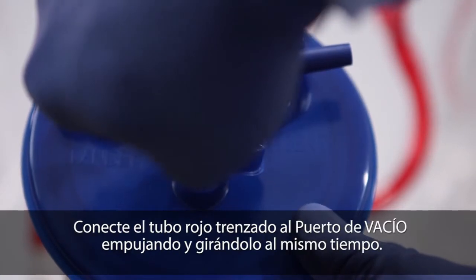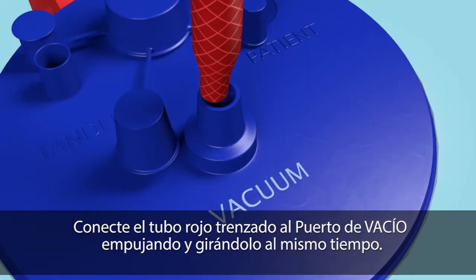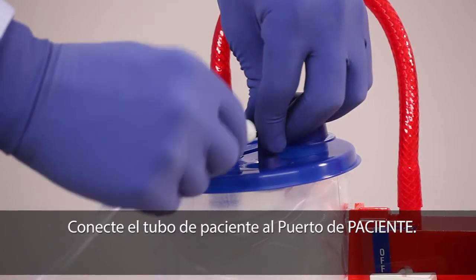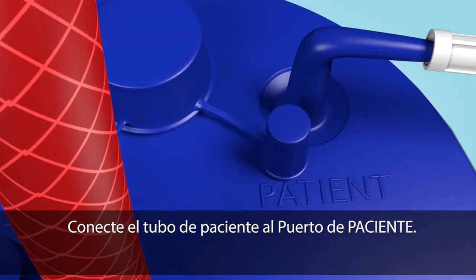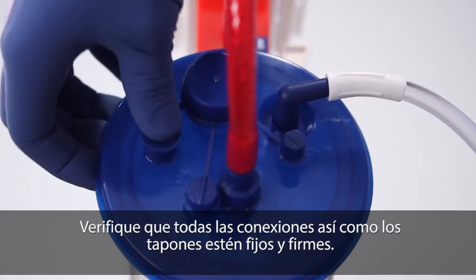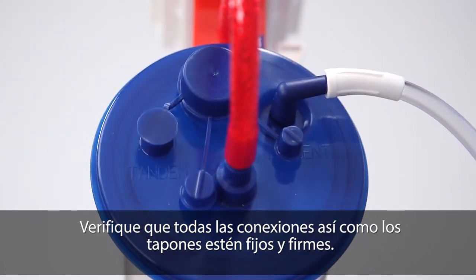Connect the red braided tube to the vacuum port using a push and twist motion. Attach the patient tubing to the patient port. Verify that all of the connections are secure and caps are pressed firmly in place.